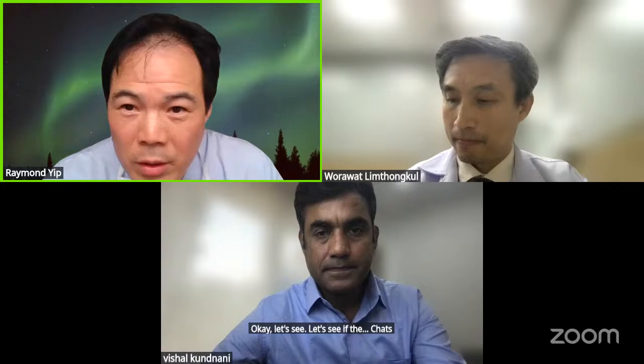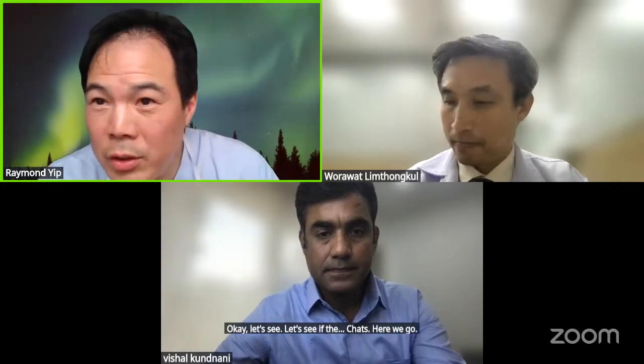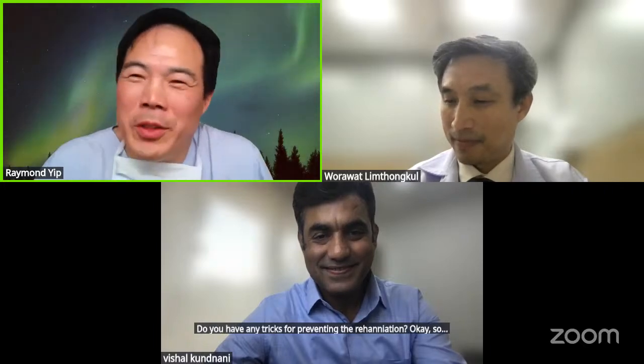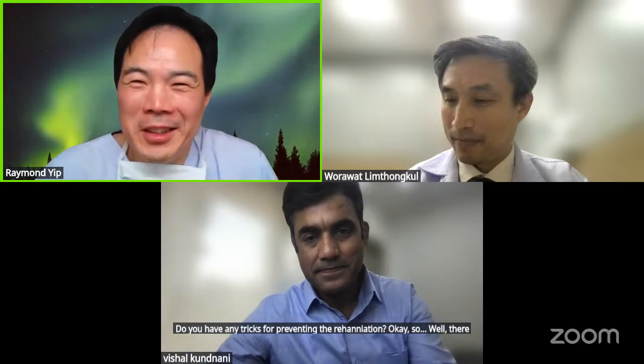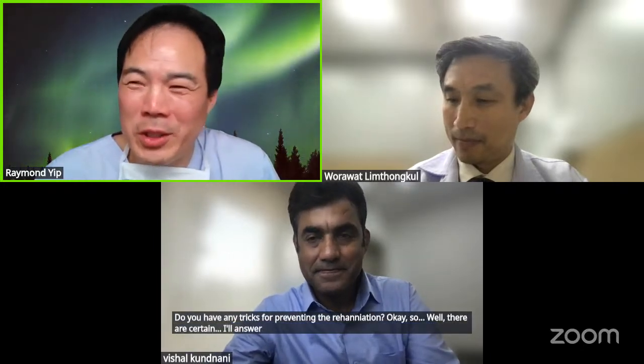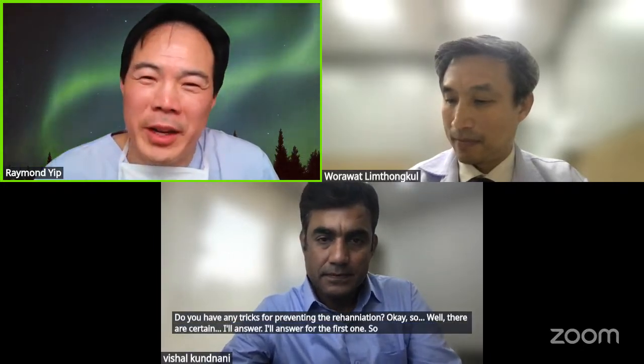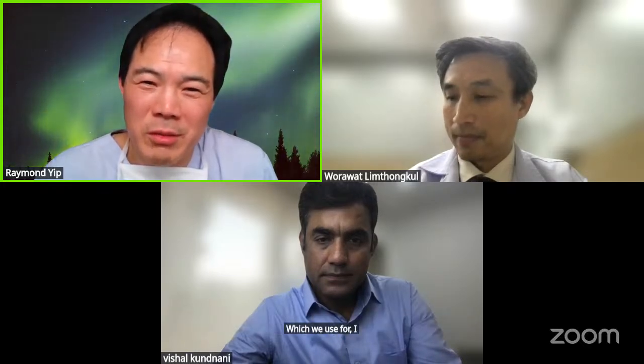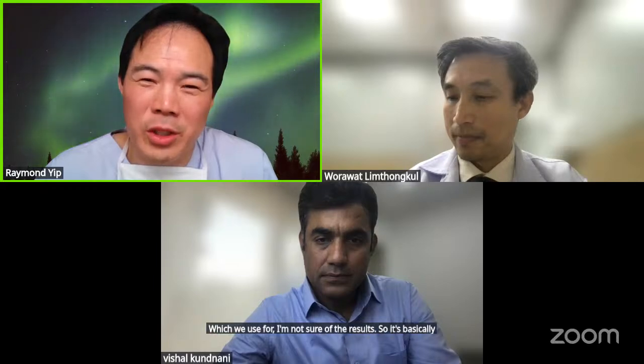Here we go. Do you have any tricks for preventing the reherniation? Okay, well, there are certain things. I'll answer for the first one. There's something called a Barricade. I'm not sure of the results, but it's basically an annular closure device. It's like a little trapdoor that you put in front of a big hole.